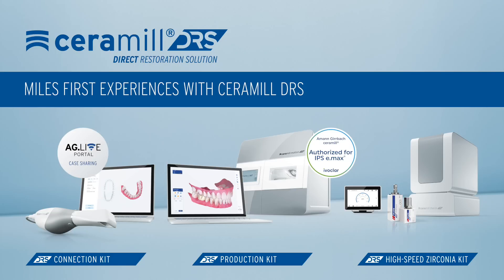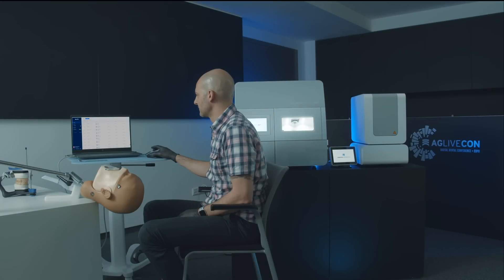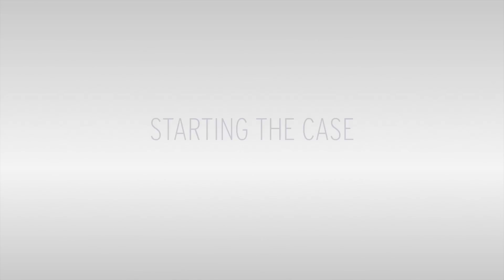For this video we decided to use a demo head instead of an actual patient because, with it being my first time operating such a system, this guy's more patient.